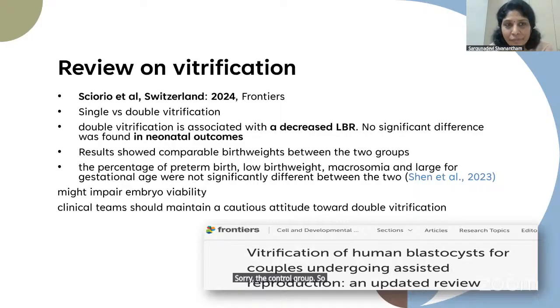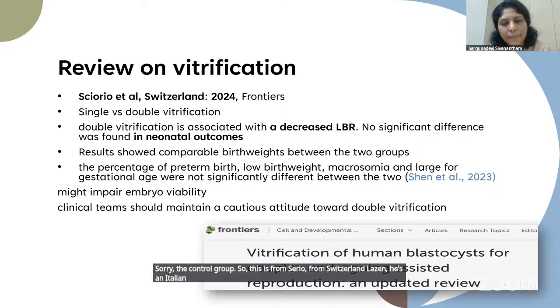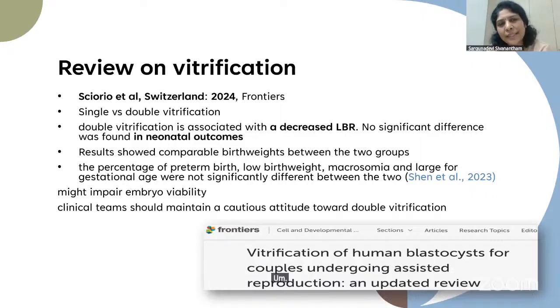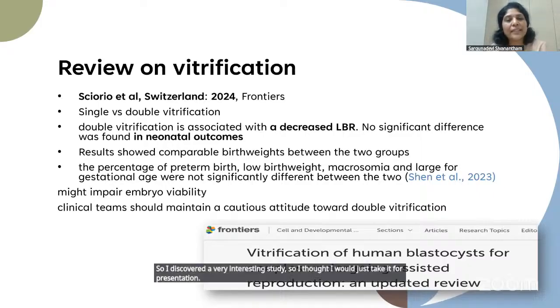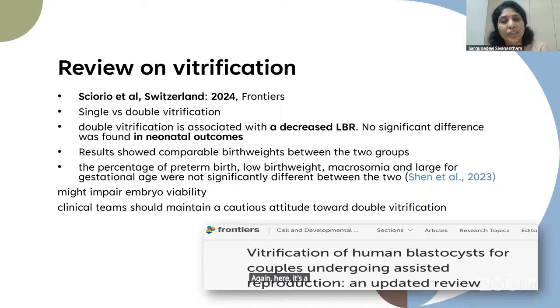So this is from Serio, from Switzerland, Lausanne. He's an Italian. We see him quite often here. So this is a review on vitrification, and there is a part for double vitrification as well. So I discovered a very interesting study, so I thought I would take it for presentation. Again, here single versus double vitrification have been compared. And what they found was a decreased live birth rate, but for neonatal outcomes, again, no significant difference was found between the groups.